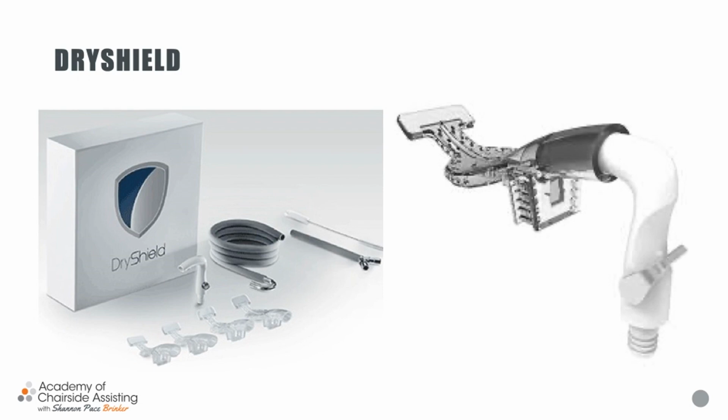Now let's talk about the dry shield. One of the things that I want you to really think about is the dry shield compared to the Isolite 3. The dry shield does not have a light, okay? But there's a lot of good perks that I really enjoyed about the dry shield, and that's what I want to mention. It is a high volume isolation system, very similar. And it does have bite blocks that are firm.